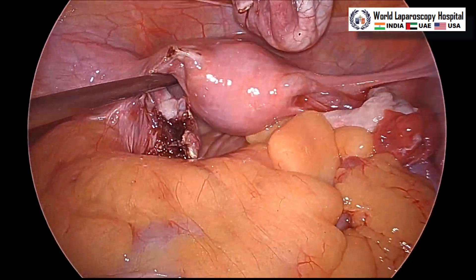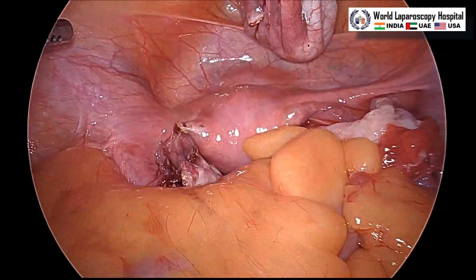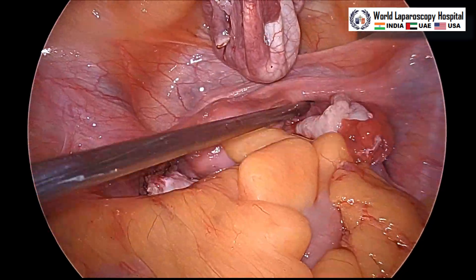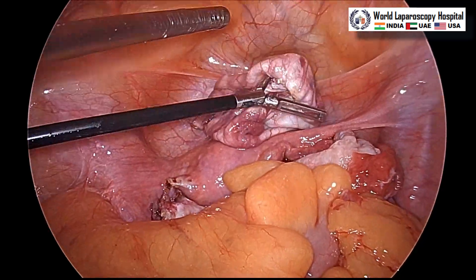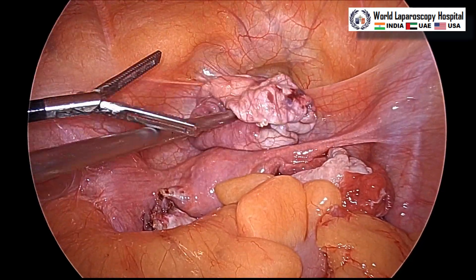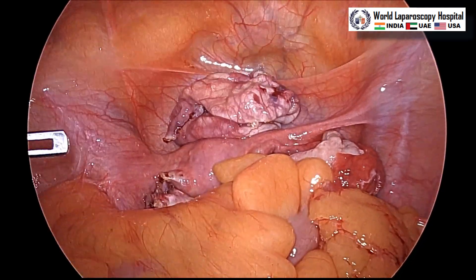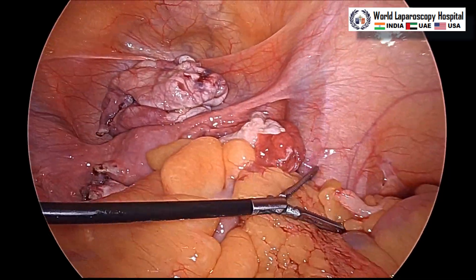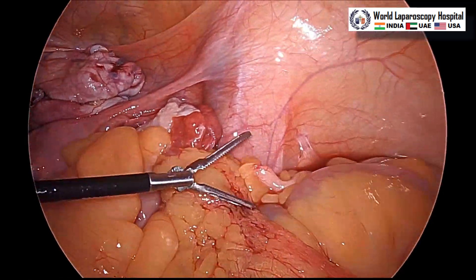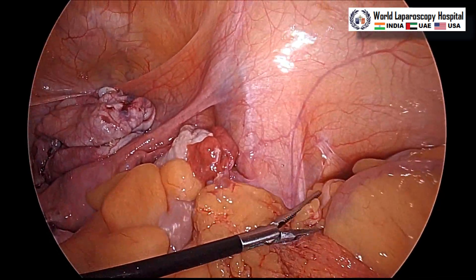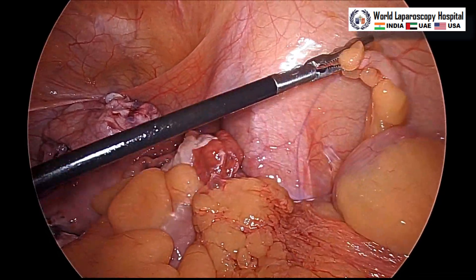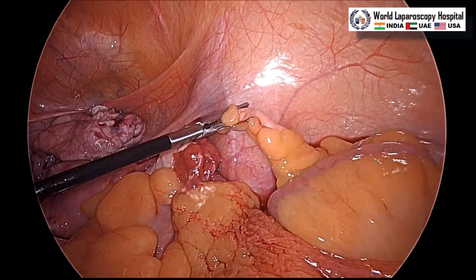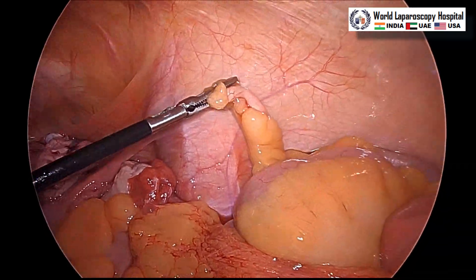The suction is going to the anterior cul-de-sac and posterior cul-de-sac, sucking all the fluid. This is simple cystic fluid so there is no concern about metastasis or any other issue. After that we will go to the appendix and remove it. The atraumatic grasper is holding the appendix, giving anterior traction.